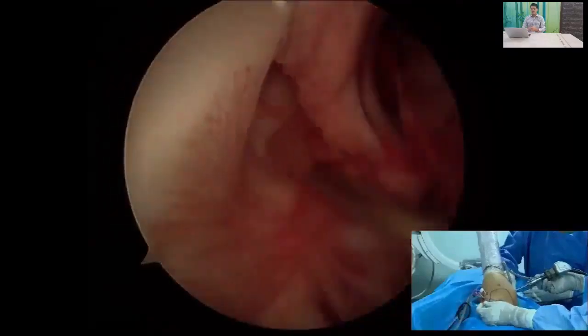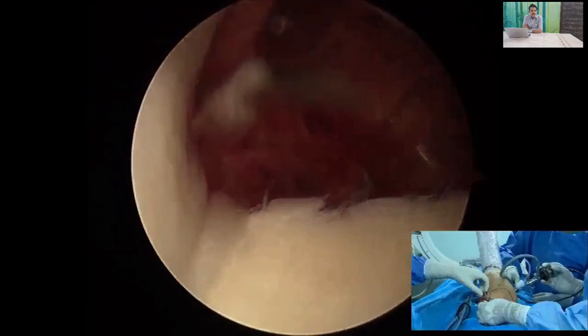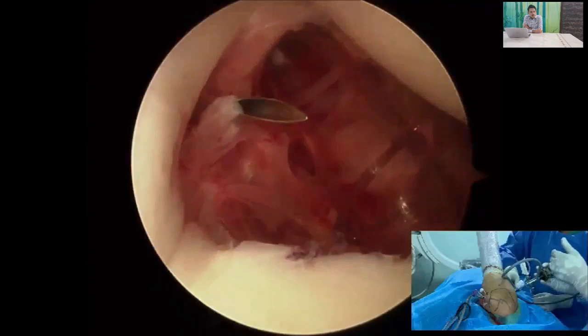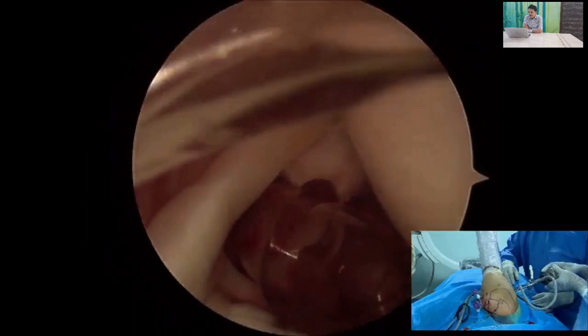A simple technique for arthroscopic Bankart repair. We make a posterior viewing portal and two portals on the anterior side: one anterior superior portal and one anterior portal. The anterior superior portal should be made parallel to the glenoid, and the anterior portal should be made at the junction between the biceps and the subscapularis. This is the final view of the portals.